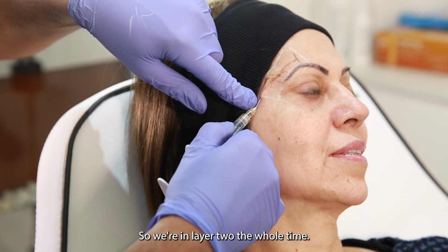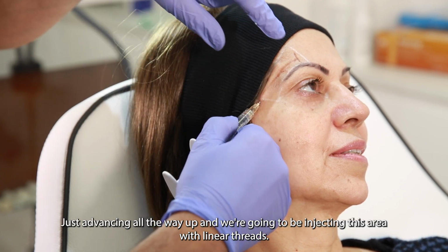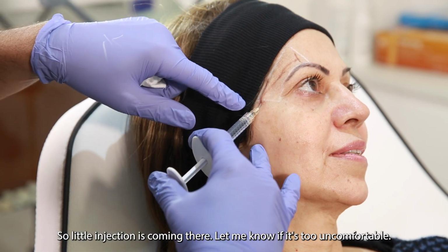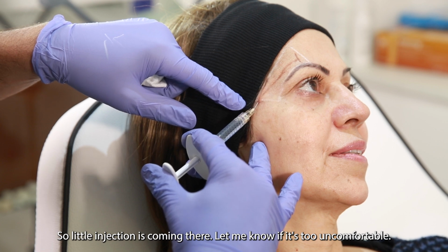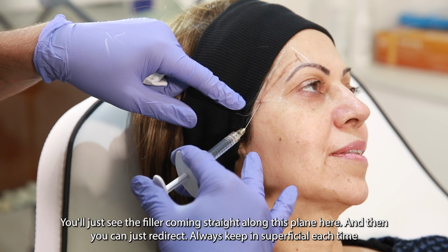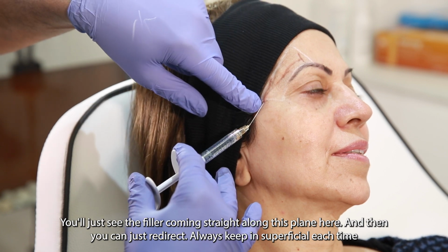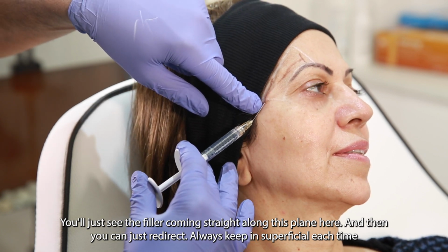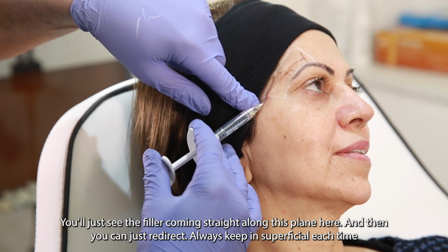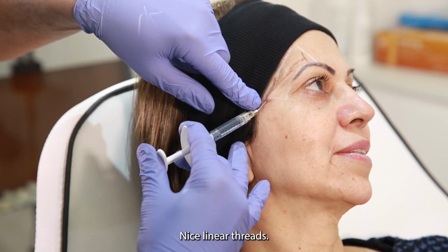So we're in layer 2 the whole time, just advancing all the way up. And we're going to be injecting this area with linear threads. So little injections coming now, just let me know if it's too uncomfortable. You'll just see the filler coming through along this plane here. And then you can just redirect. Always keeping superficial each time. You okay? Yeah. Same again. Nice linear threads.